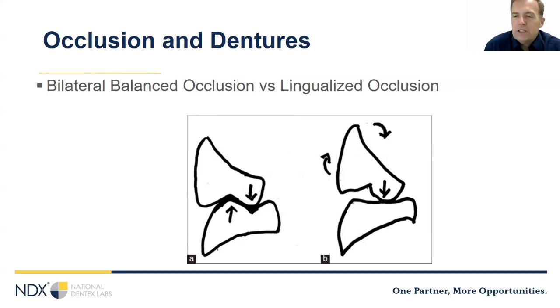But with the aforementioned flat chewing motion common to most denture wearers, these teeth with high cusp angles, especially if they oppose each other, can create excessive lateral interferences and lead to tipping. And it's best to use 22 degrees or less on your full dentures.